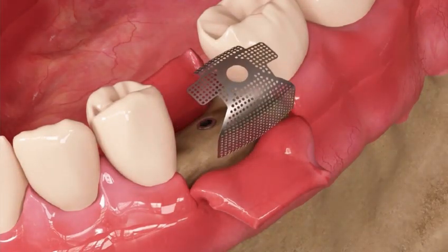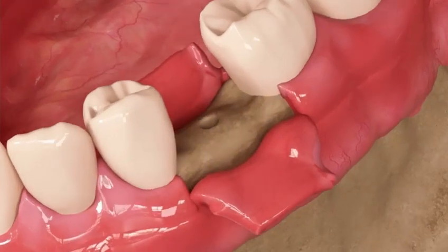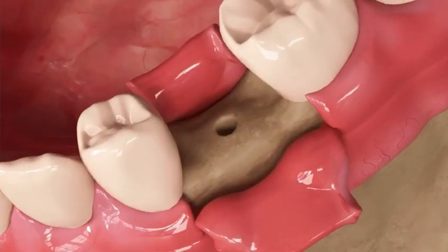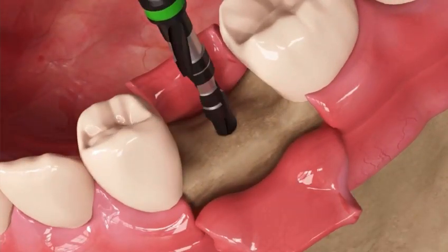That's it. Additionally, you can use the hole left after the tenting screw as part of the implant installation protocol.